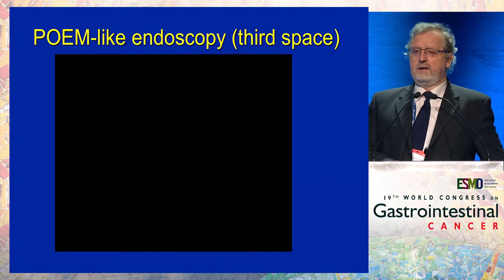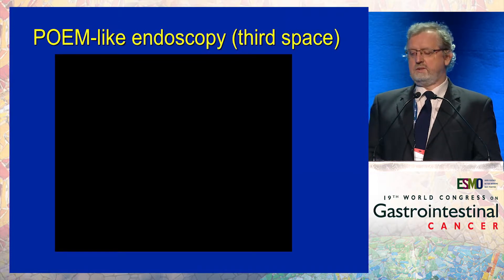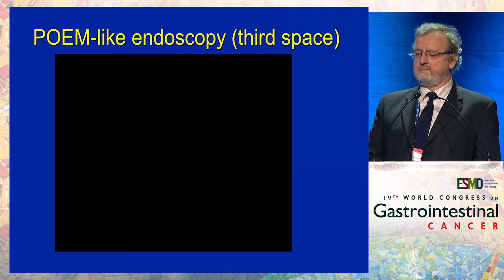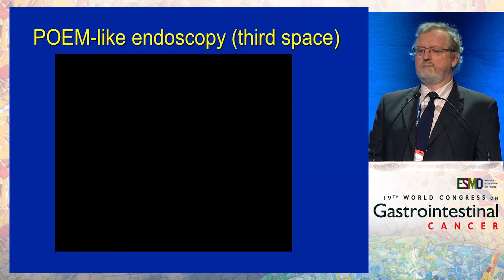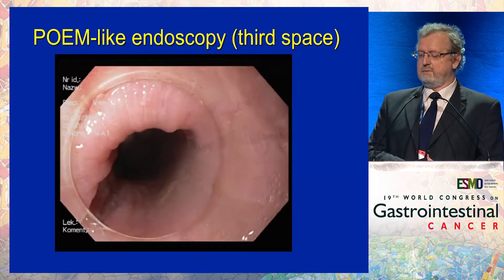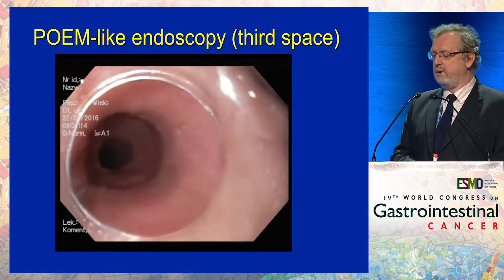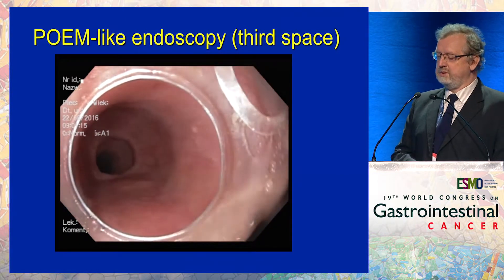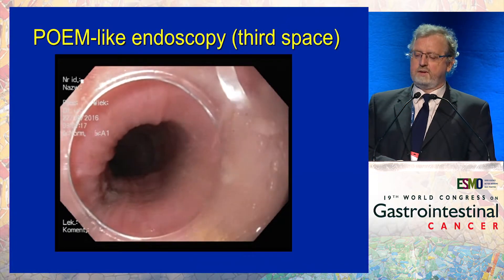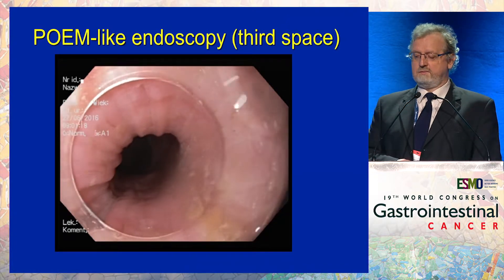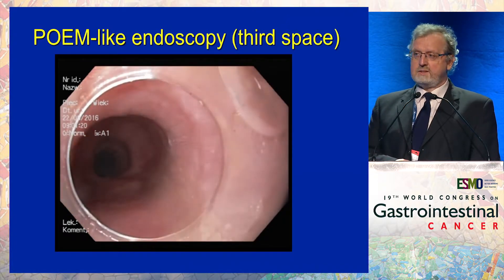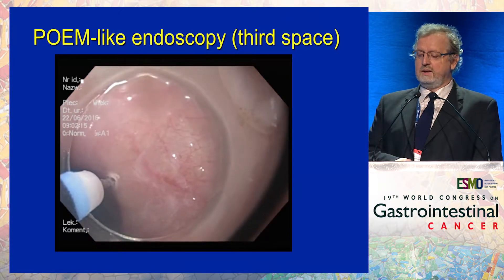Another idea already present is using the third space — the space between the submucosa and the muscle layer. To show you that it's possible and easy, I want to show you the POEM procedure. We are in the middle esophagus and it is a very easy, very safe procedure.